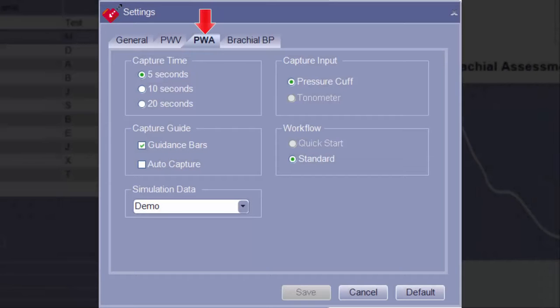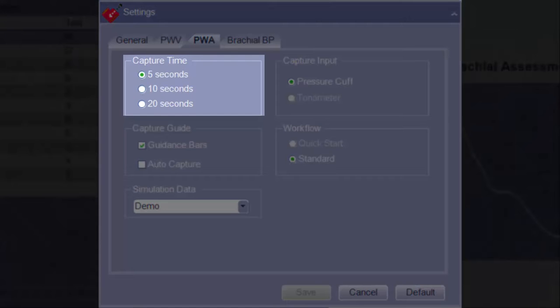The third tab of the Settings screen is the PWA tab. This tab has settings related to pulse wave analysis assessments. The Capture Time option allows for the selection of the amount of time desired to capture waveform data during pulse wave analysis assessments. The default and most commonly used capture time is 5 seconds.